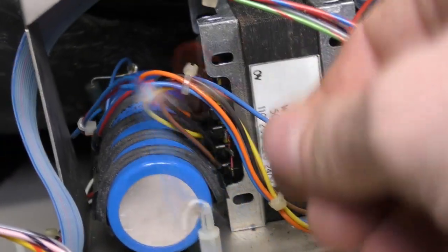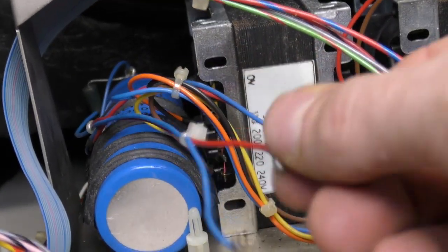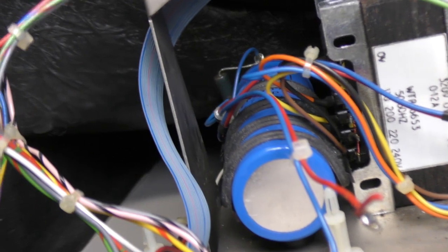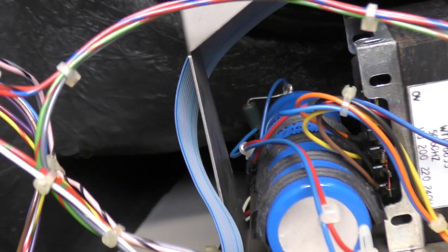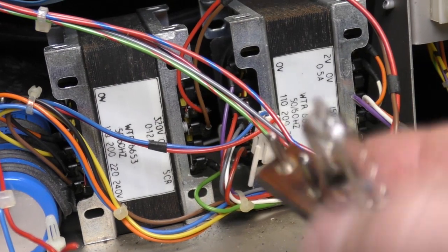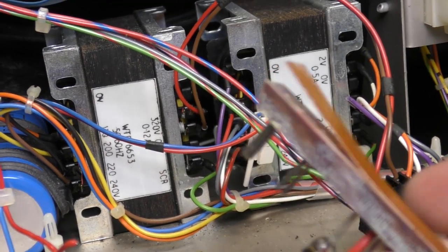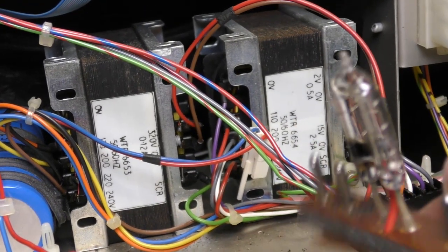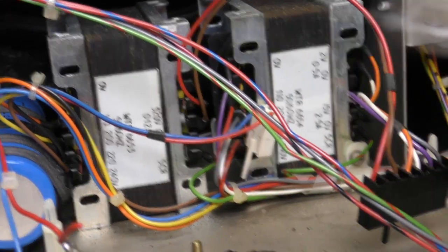So I've just peeled off the insulating tape, and these connections, they're soldered. I was expecting to see some sort of twisted bodge, which would explain where those sparks were coming from, but those ones seem to be okay. I think the end of the cap is too far away for them to be coming from there. I can only think that maybe these pins weren't tight enough, and that was causing it. But it's a bit of a mystery where those sparks were coming from when the flash tube fired sometimes.